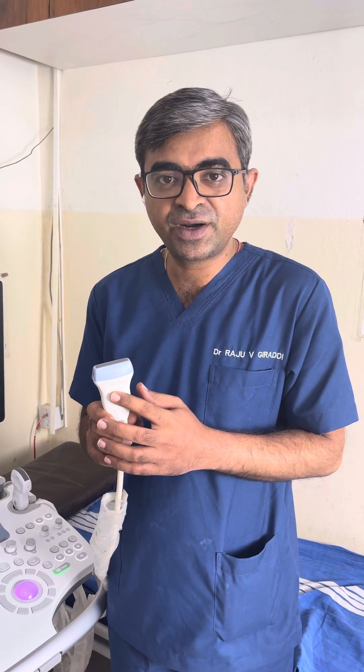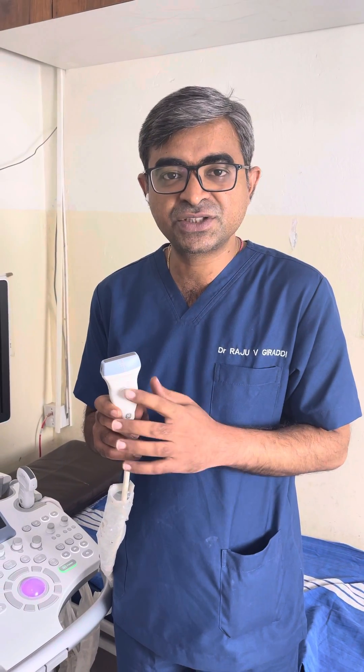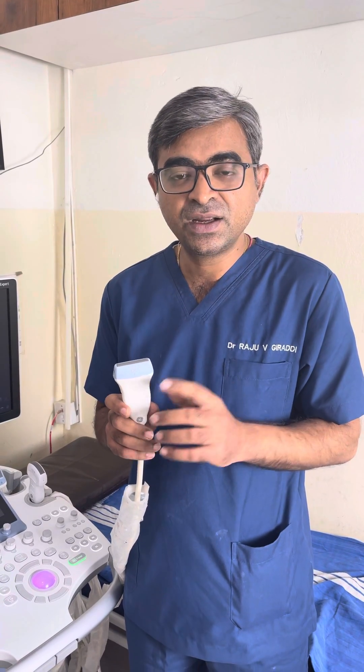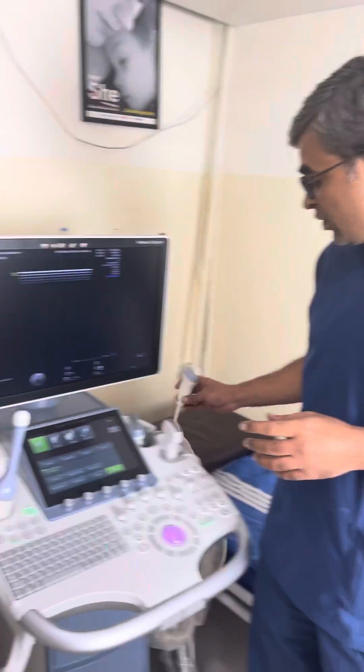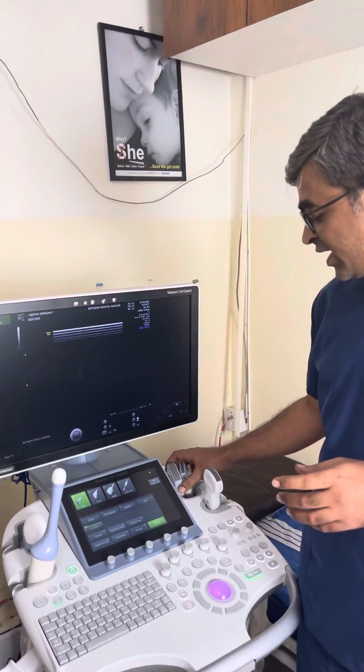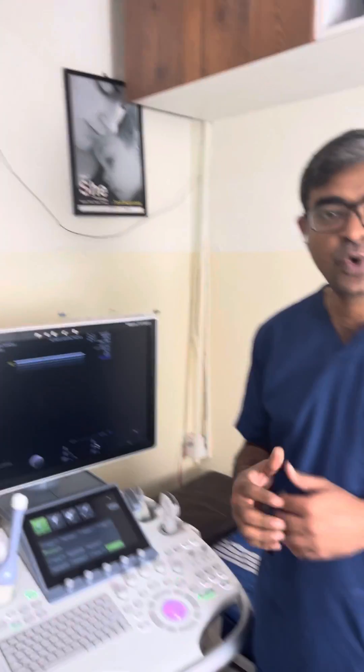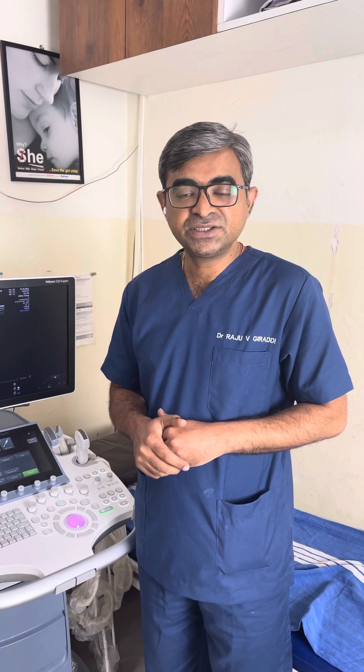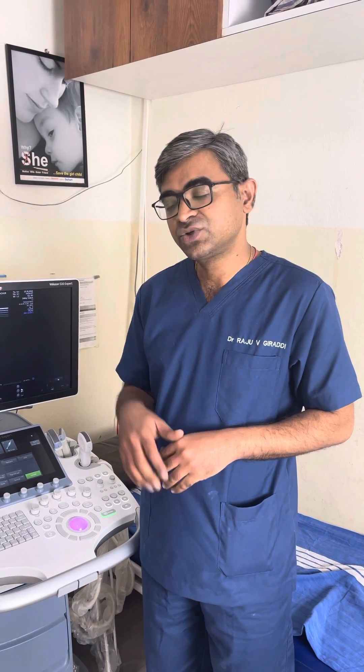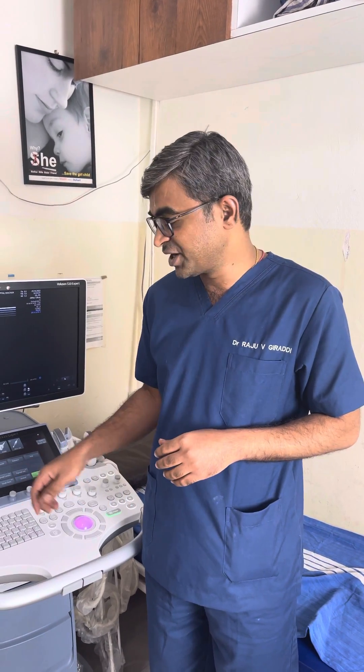For example, the linear probe is better when trying to see superficial structures from the basal layers of the skin to the rectus. In fetal medicine, you can use these probes when the baby is prone and you want to study the spine in more detail. Convex probes, as explained, help with deeper penetration — the higher the frequency, the lesser the penetration.